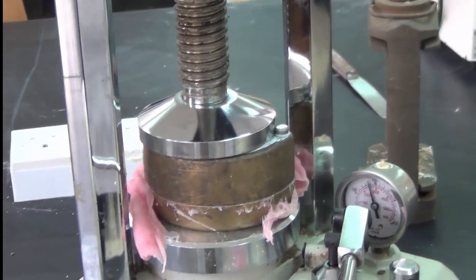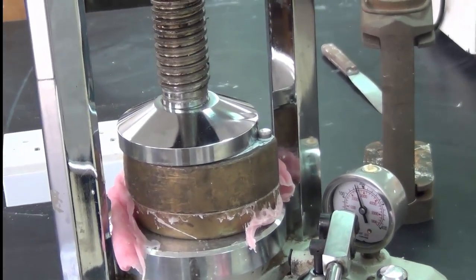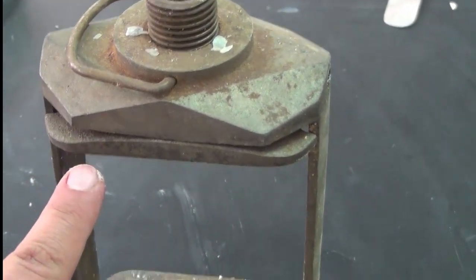We will maintain this pressure for around 5 minutes, and then we will remove it and immediately turn it under pressure, but we're using another device called the frame or clamp. It's a metal frame that will contain 2 flasks if we're doing an upper and a lower flask, and we will rotate it using a handle from this opening, and this will press this down, and it will maintain the pressure of the acrylic during the curing period.